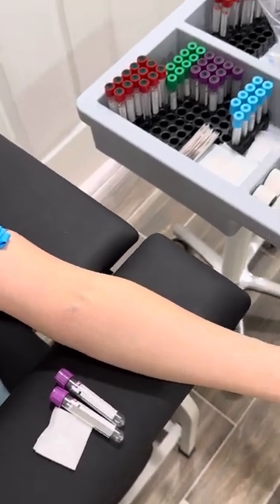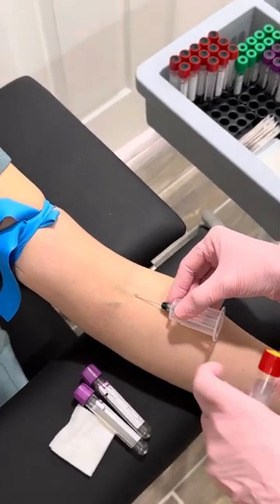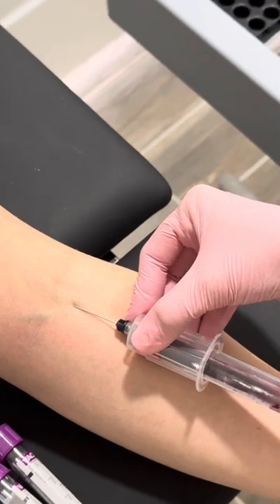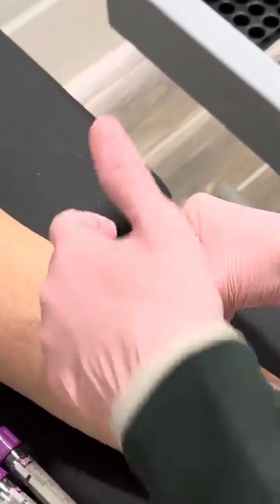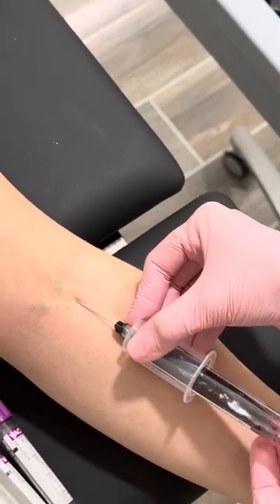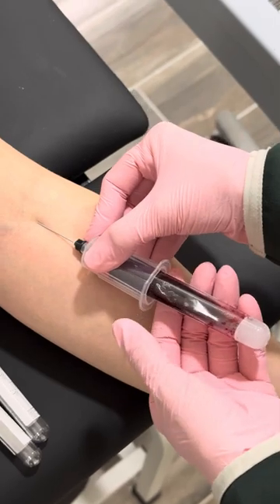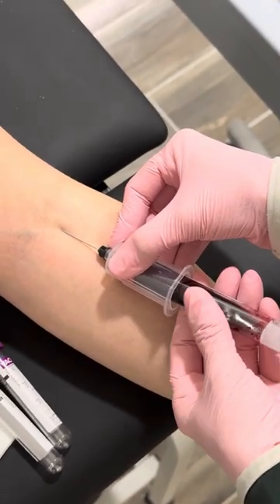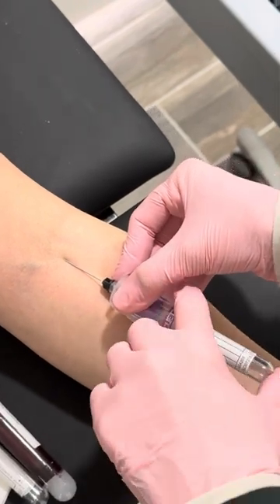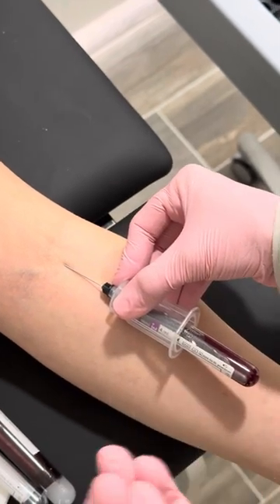Get your tubes ready while this is drying, because you want to make sure it's dry before you stick — it really burns if you don't. We're going to go at the bottom right here, then you just anchor your hand down with your fingers. You don't want to move this hand at all; you only move this one.